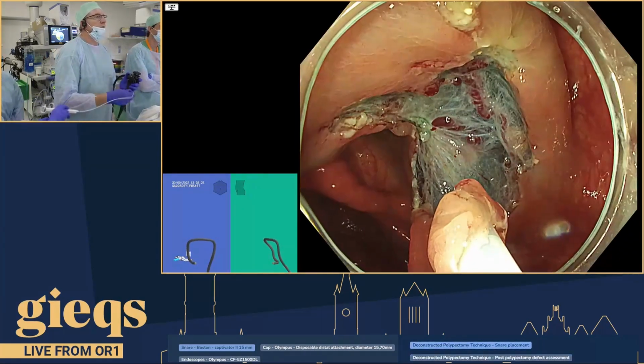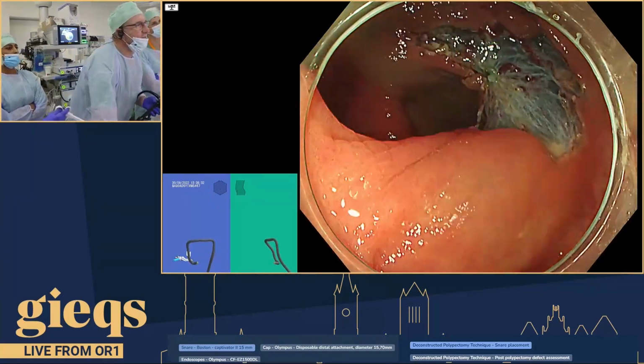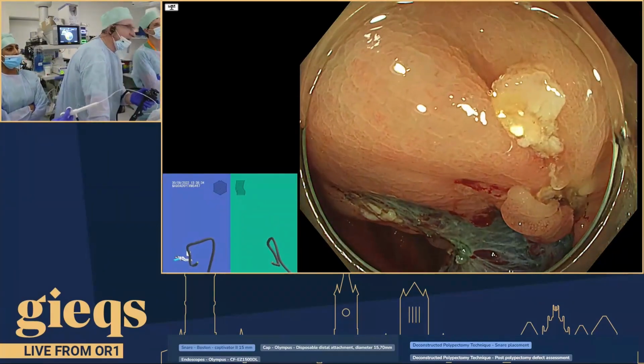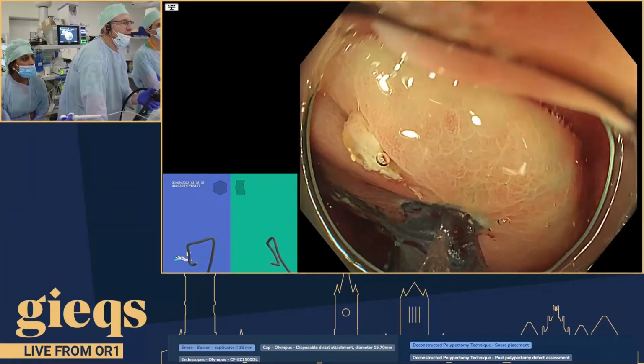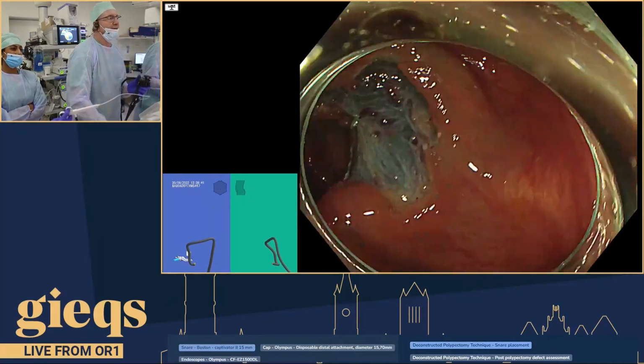Okay. What do you mean by fulcrum technique, Michael? Well, I missed it. Why would that have made it easy? All right, we've got to make John Anderson happy. So, do you mind just pushing on the transverse colon for a tick?